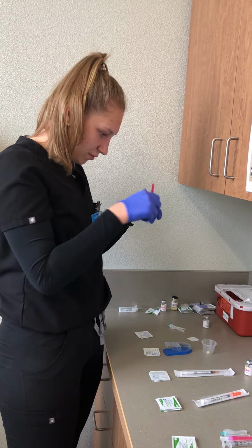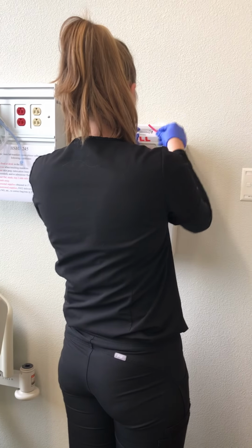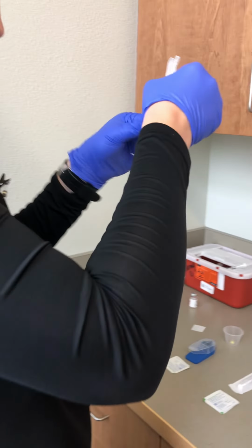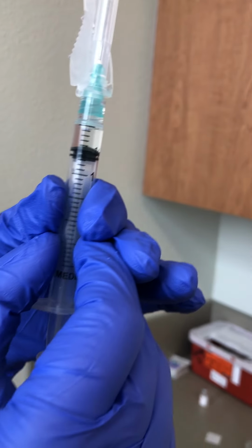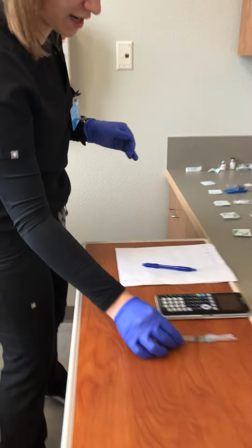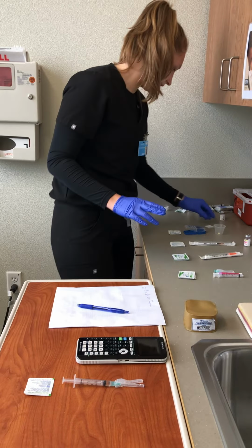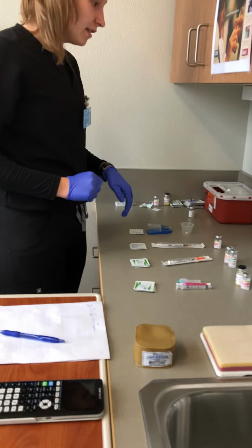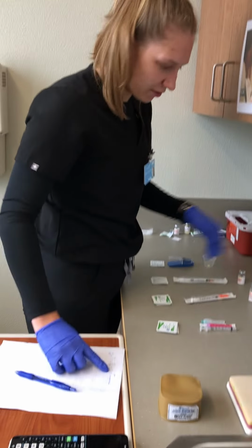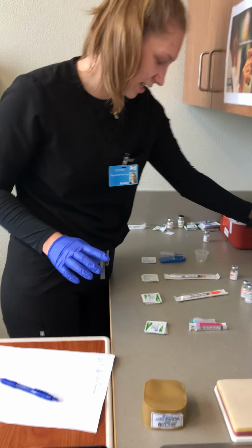I'm going to take this off, discard. I'm going to place on a new syringe tip. As you can see, that is 0.5 milliliters. I'm going to set that there to be administered later on a swab for the skin. Okay, so next I'm going to get ready my lisinopril. Oh, and while I was doing that, I was performing my second check, so I was double checking that my correct math matched up with my MAR and what I had taken from the vial, which it did.